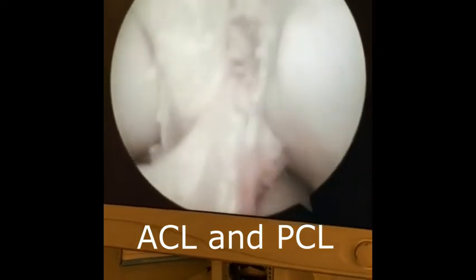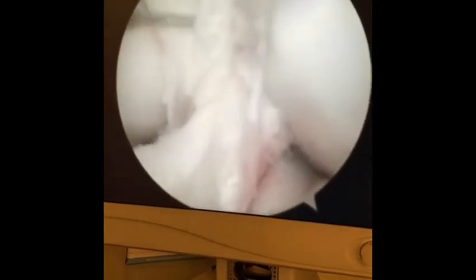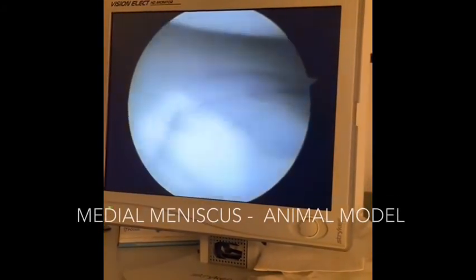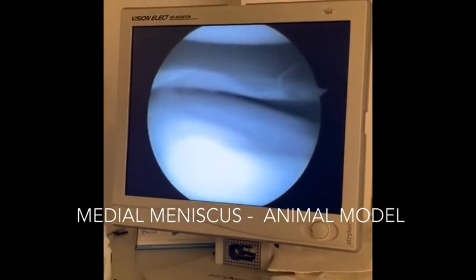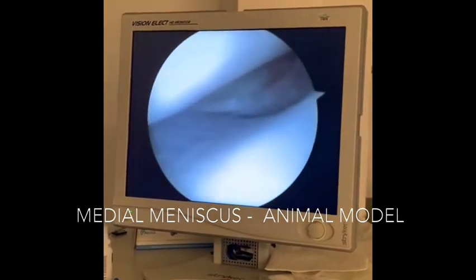We were able to observe the anterior and posterior cruciate ligaments. After, we observe the medial compartment. To facilitate visualization of this compartment, we performed a release of the medial collateral ligament, easily observing the medial meniscus. We then made a radial tear in the medial meniscus body for subsequent meniscus suture training.